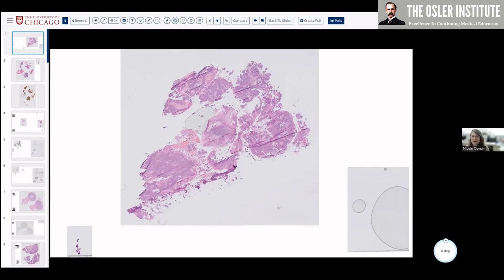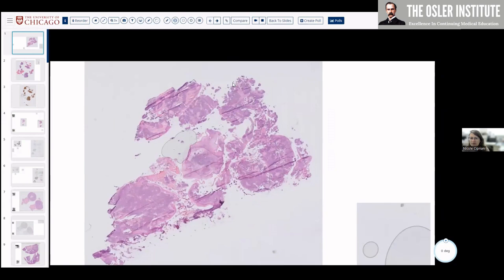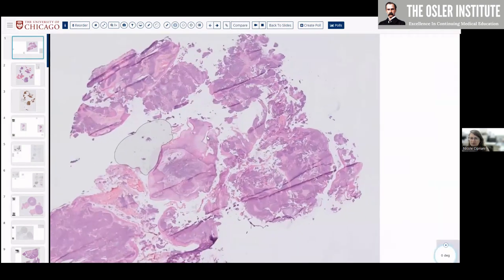Okay, so I've got some head and neck stuff. I've even got some endocrine thyroid stuff. I've got some bone, soft tissue, salivary, whatever. So we'll get through what we can. I kind of wanted to start with some bread and butter things that I think are going to be useful not only for boards, but also for your clinical practice.